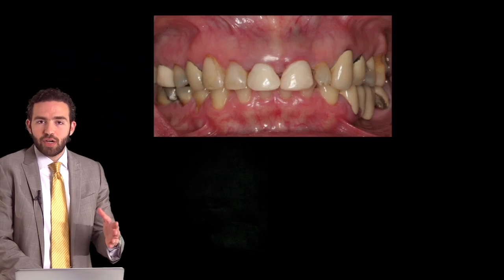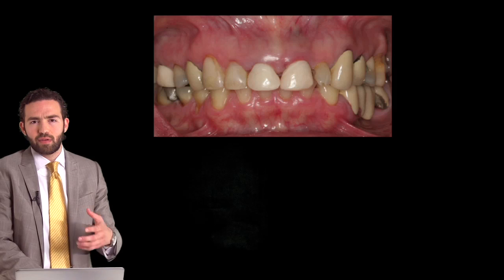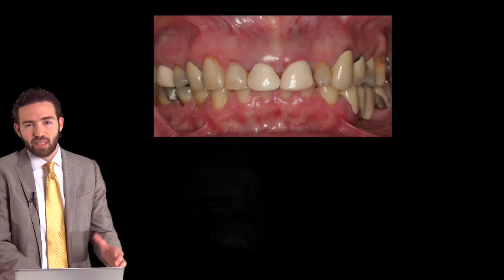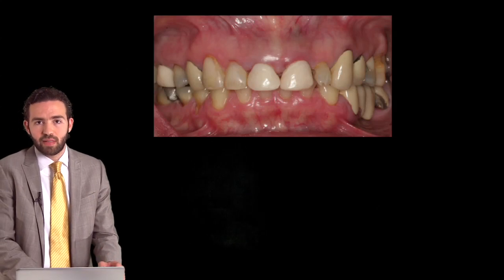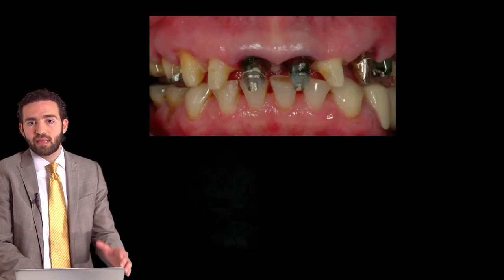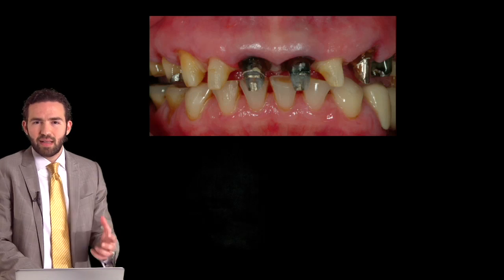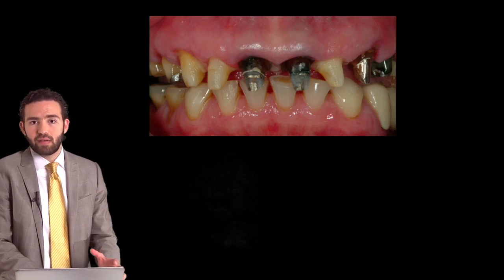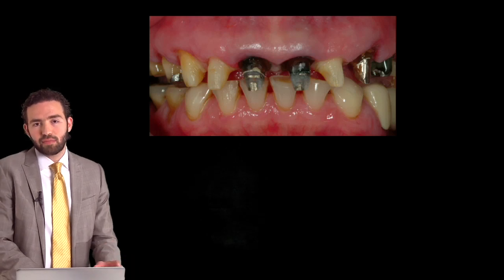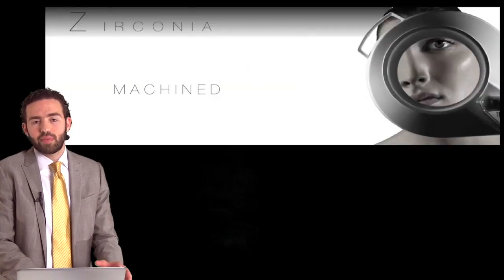I'm going to try to demonstrate that through a case where we did that in the early stages of zirconia, when it was still in the experimental stage and we didn't know much about the optical properties of zirconia restorations. In this instance, after the teeth have been prepared, you see the differences in substrate. We've got highly discolored abutments and fairly good colored abutments. We were kind of new to zirconia restorations. We said, you know what, let's use zirconia-based restorations.